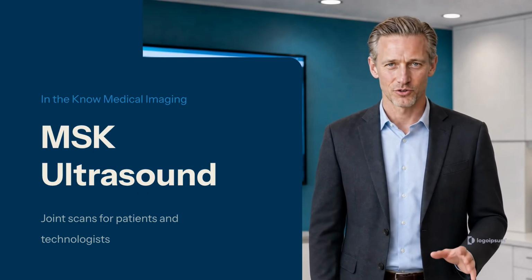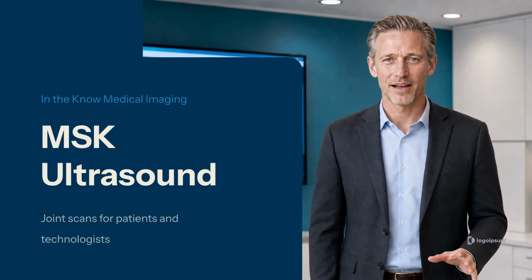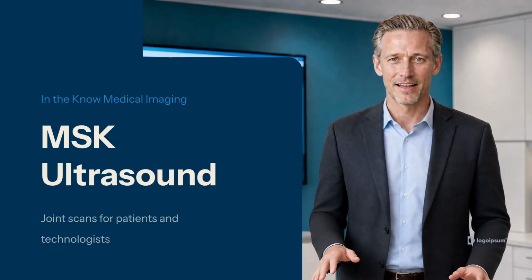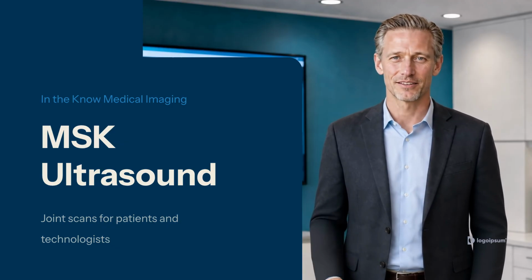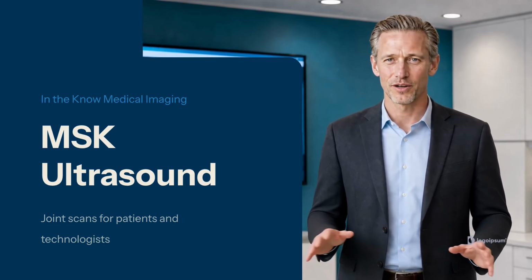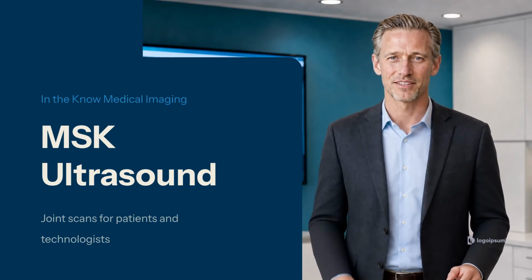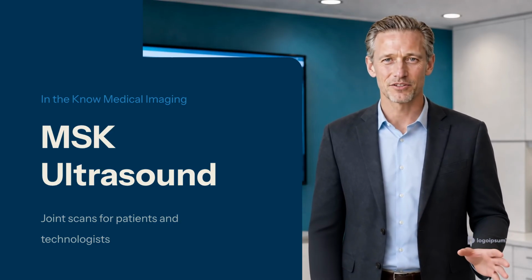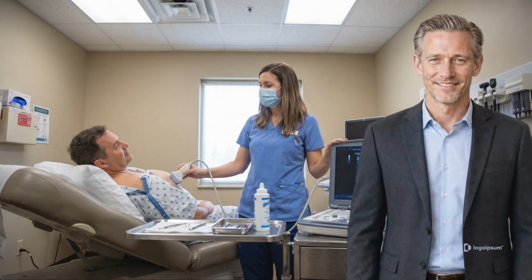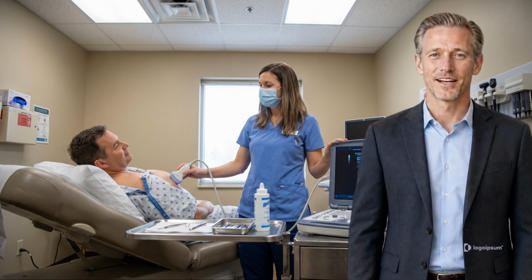MRI is famous for joint imaging, but ultrasound has a unique superpower: real-time dynamic movement. Today, we are exploring musculoskeletal ultrasound. We will explain what patients experience during joint scans while breaking down high-frequency transducer physics, anisotropy artifacts, and power Doppler for our technologist community. For patients, an MSK ultrasound is completely painless, safe, and interactive.